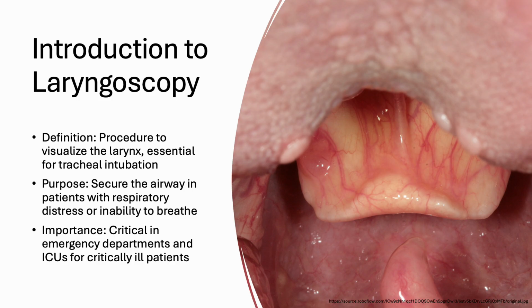This is a high-stakes procedure where precision and speed are vital, as failure can lead to severe outcomes like hypoxemia or aspiration. We'll look at two main techniques, direct and video laryngoscopy.